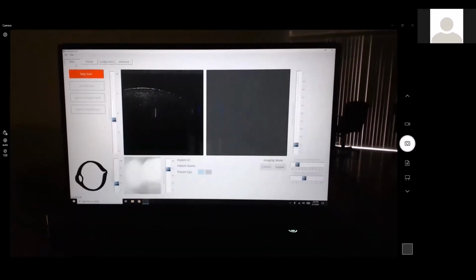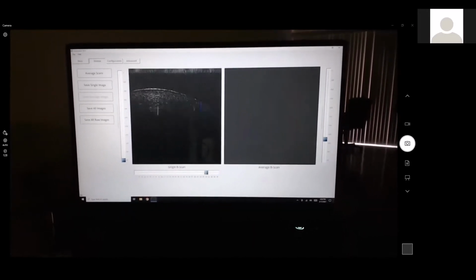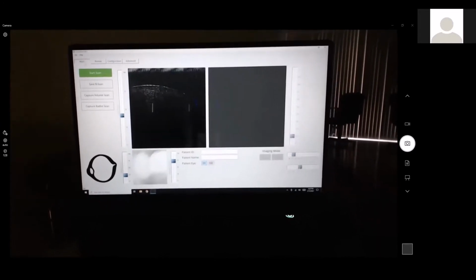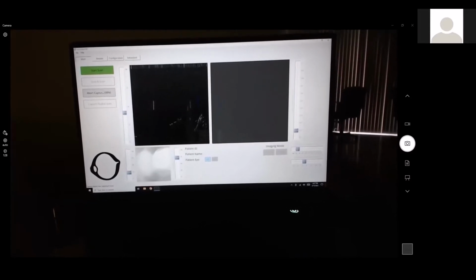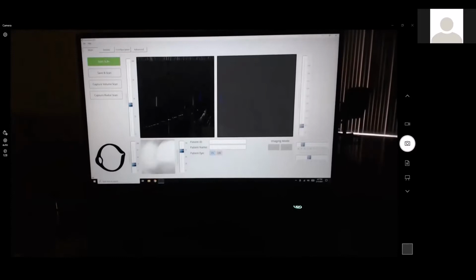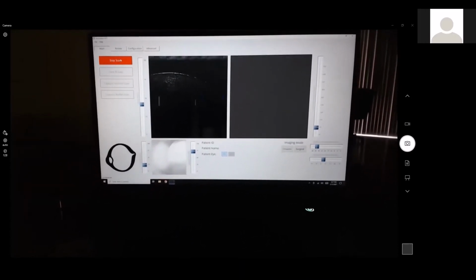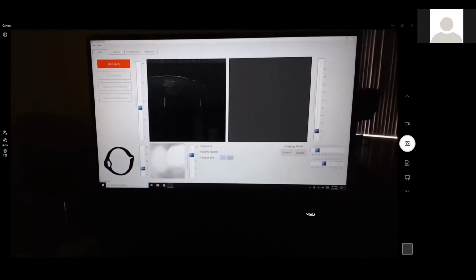Okay, so that's cornea. One of the things we can do real quickly here is let's do an OCT volume scan, since we already have the 2D. Oh, that was a very fast one. I guess it must have been set to like 16 frames or 64 frames. Let's capture a little bit more this time. Now what you can see is starting to go layer by layer through the cornea. And this was actually very nice and stable data.